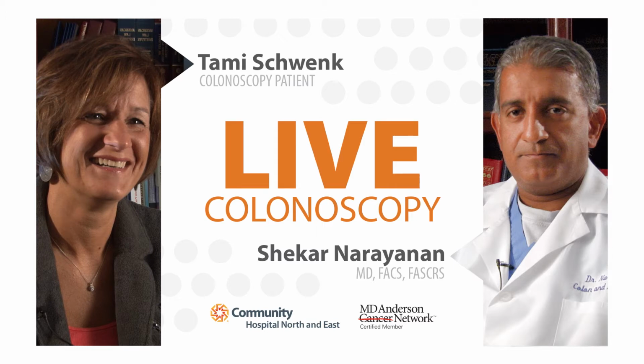Welcome to Community Health Network's first ever live stream of a colonoscopy. Colonoscopy is a safe, effective method of examining the lining of the colon to diagnose colorectal problems and to perform biopsies and remove colon polyps. Most colonoscopies are done on an outpatient basis with minimal inconvenience and discomfort.